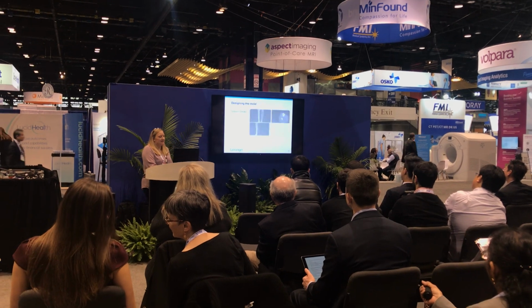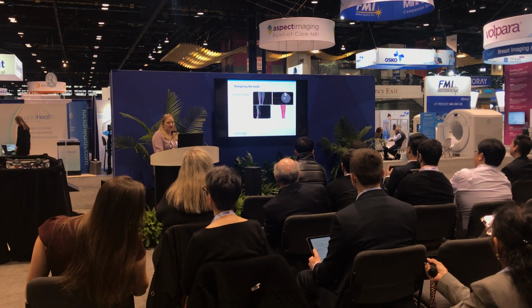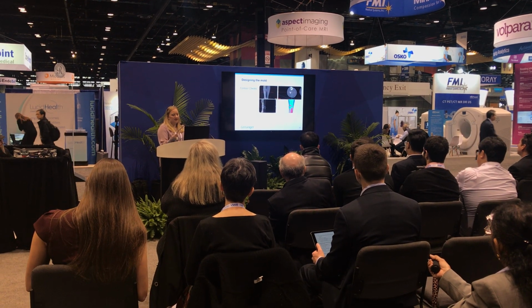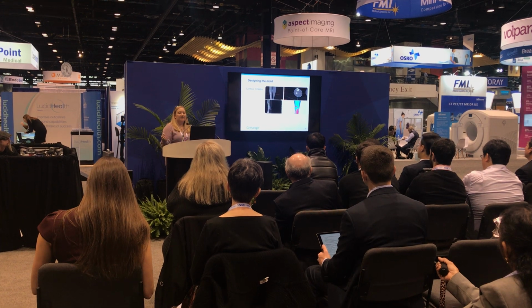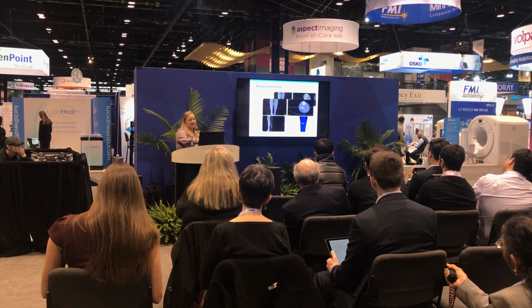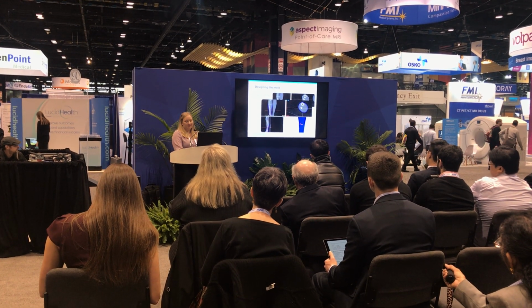Contour checks, like I said, they're the same as well. I'm just gonna run through these here: bones, muscle, fat, and skin, and I'll slow down on the actual traumatic wound. Normally on a 3D medical model, you're not going to see a differentiation in these contours, but when you're simulating something, obviously, it's going to be different.